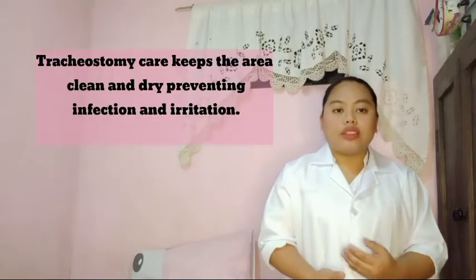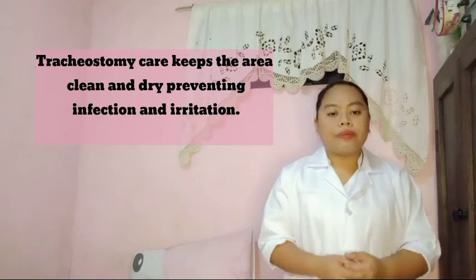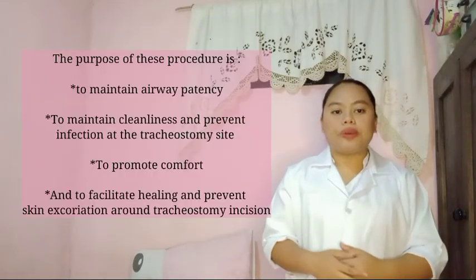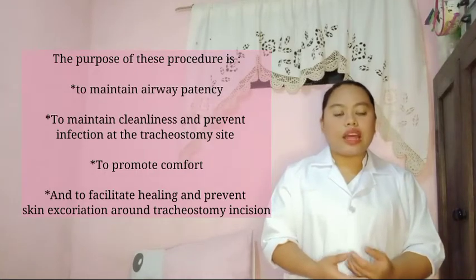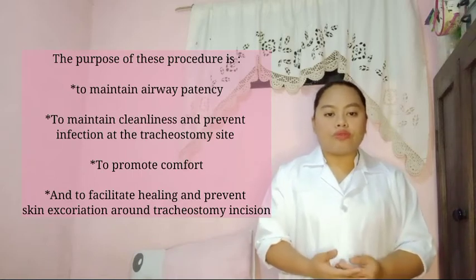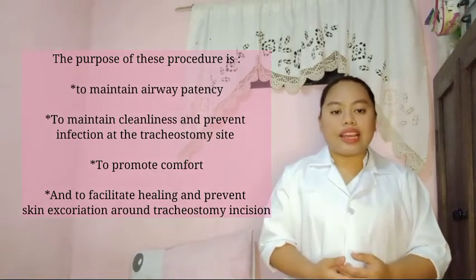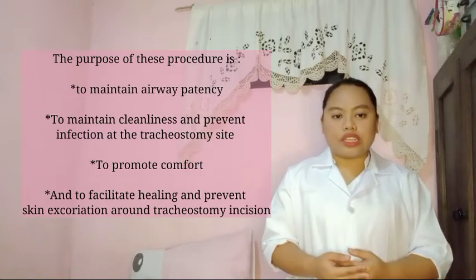This video is about providing tracheostomy care to the client. Tracheostomy care keeps the area clean and dry, preventing infection and irritation. The purpose of this procedure is to maintain airway patency, to maintain cleanliness, and prevent infection at the tracheostomy site, to promote comfort, and to facilitate healing and prevent skin excoriation around the tracheostomy incision.